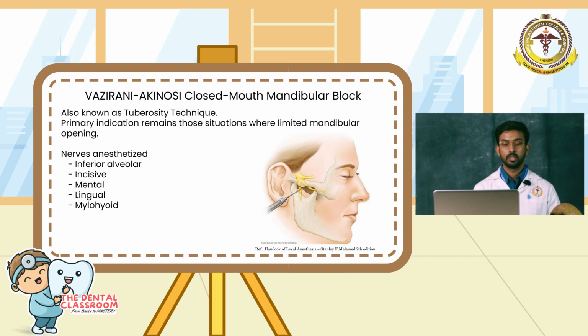So, let us see about another technique, the Vazirani-Akinosi closed mouth mandibular block. This is also known as closed mouth nerve block because it is indicated in patients who have reduced mouth opening. This is also known as the tuberosity technique. The primary indication remains those situations where the patient has limited mouth opening.